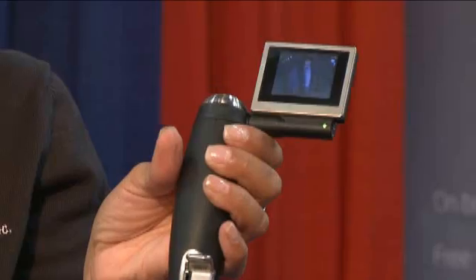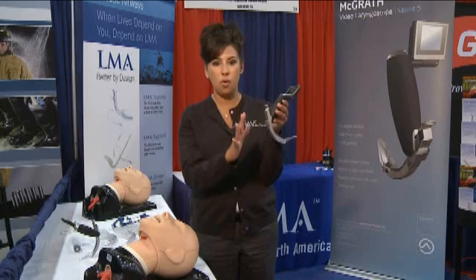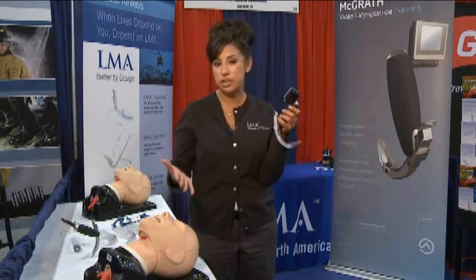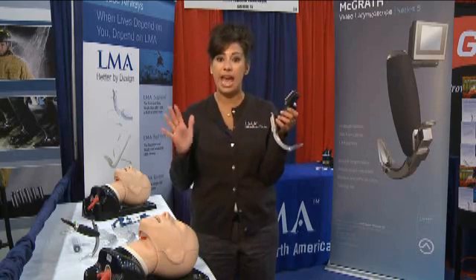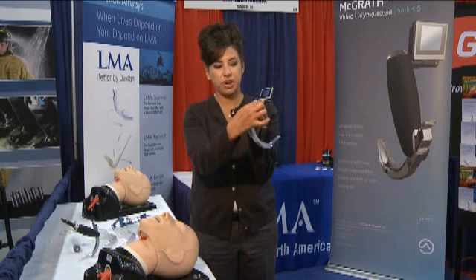This is the world's first fully portable video laryngoscope — no cables, no wires. It has a very fixed angle, so it lets you intubate your patient without manipulating the anatomy at all. You turn it on here and it has an LCD screen.